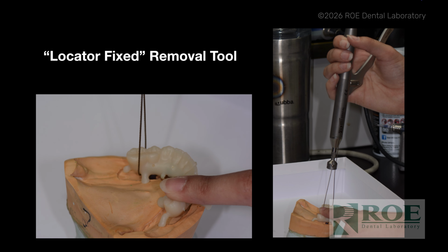Now in this case, in this slide, I'm using the LOCATOR removal tool just as a demonstration to show you how you remove these in the mouth. In the lab, I would probably just use a lab knife to pop the prosthesis off. But again, this is just to show you how you can use this tool to remove the prosthesis in the mouth at your recare appointments.